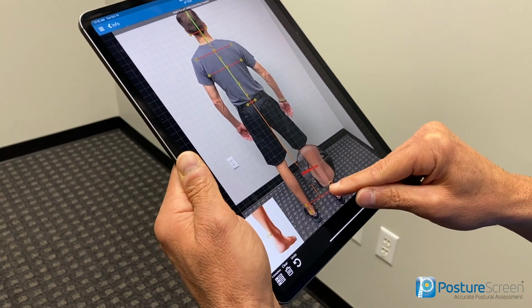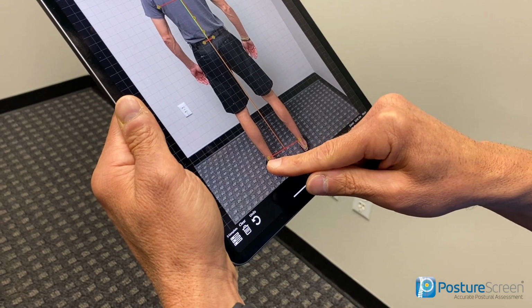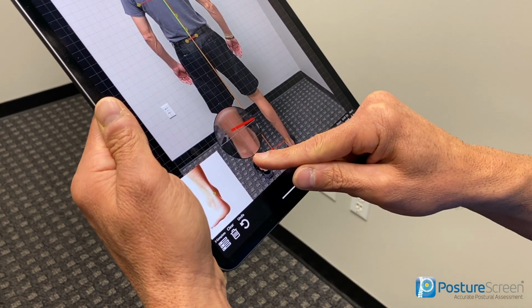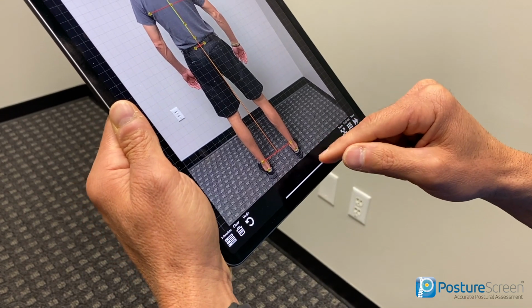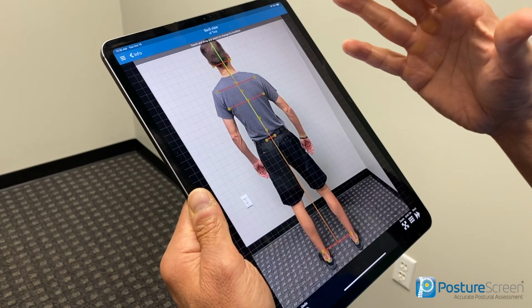But here, this is how he was standing. One foot is back, one foot is forward. Double check the Achilles tendon, make sure we get the pronation and supination correct of the foot. You can just drag those into the correct location. So my point here is that if we need to update this, we can.